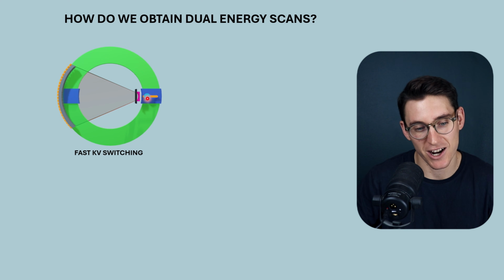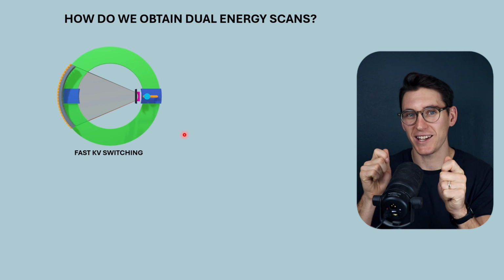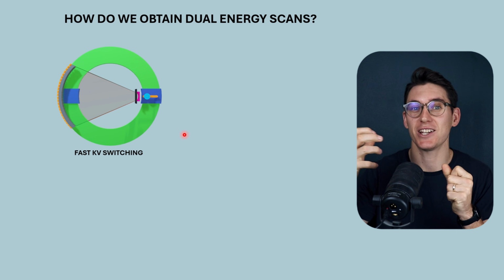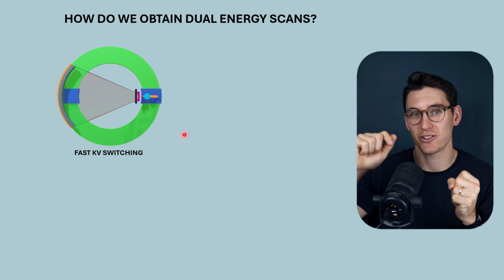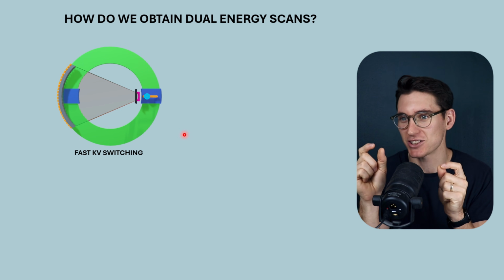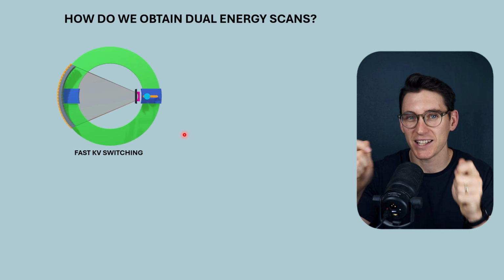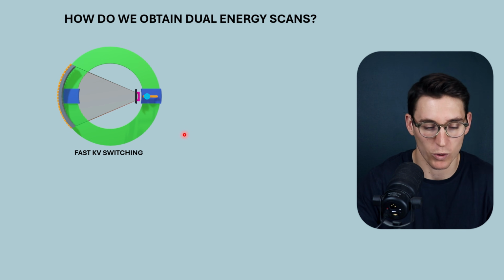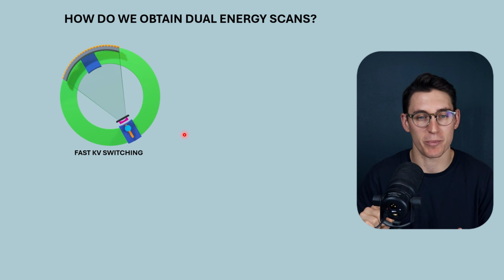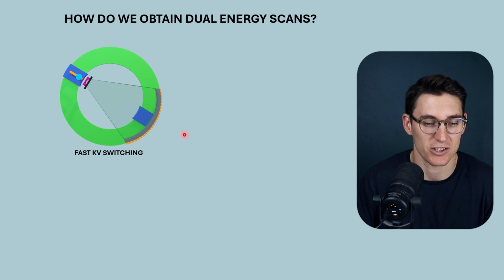Now the filament current running through the cathode is going to remain the same. So when we increase the kVp, we're going to increase the number of photons because we're increasing X-ray beam quantity and quality. So we actually want to expose the patient slightly shorter at the increased kVp as opposed to the lower kVp, to try and even out those exposures. But what happens is, as that source rotates around the patient, notice how it's rapidly switching between the 2 kVps that we've selected as the operator.